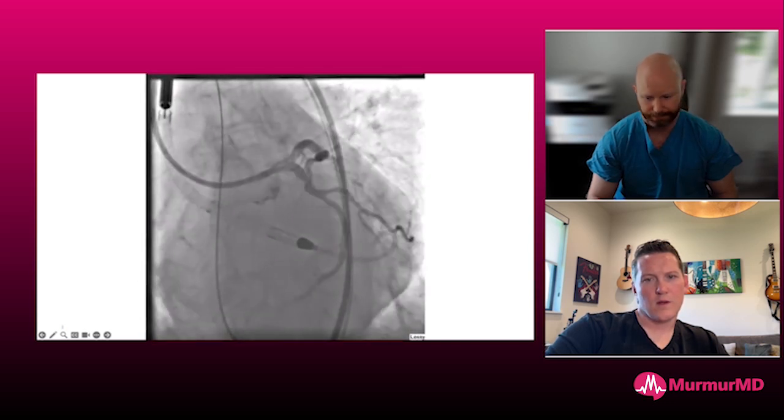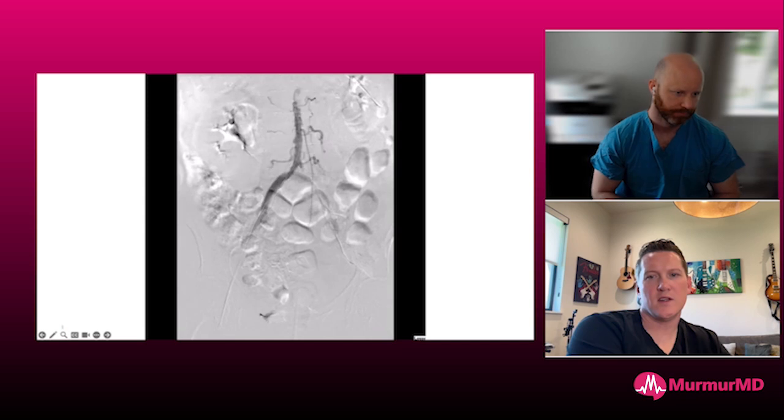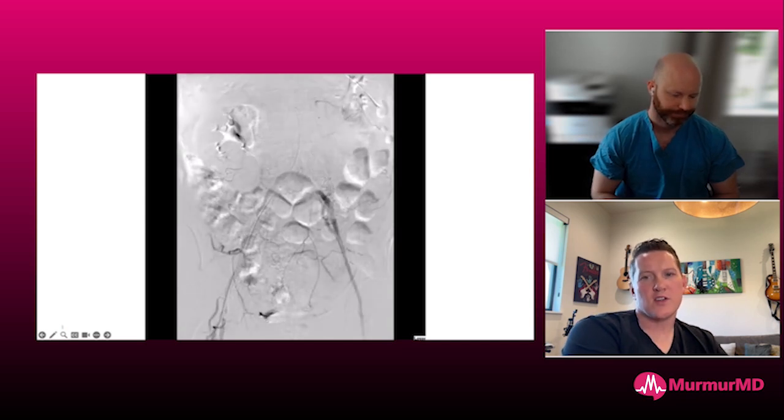She's able to wean the Impella. And then we move on to... So take me through that, Chris. You finish this complex case, you can actually see the contractilities better post-revascularization. What's your decision-making for whether to leave the Impella in or take it off?